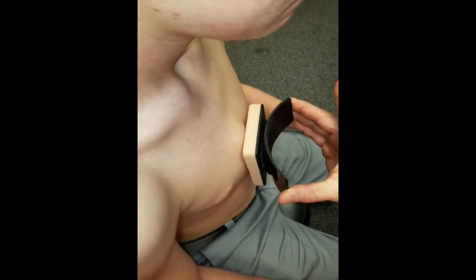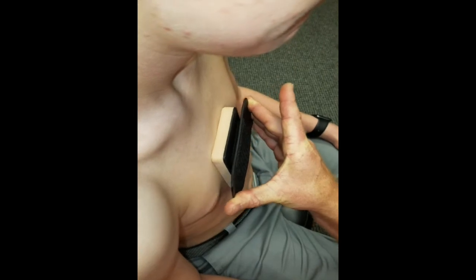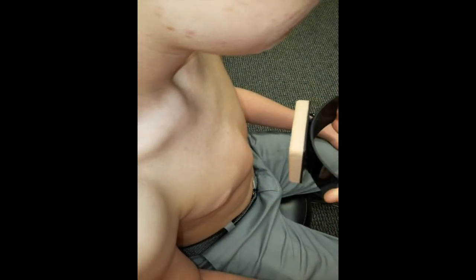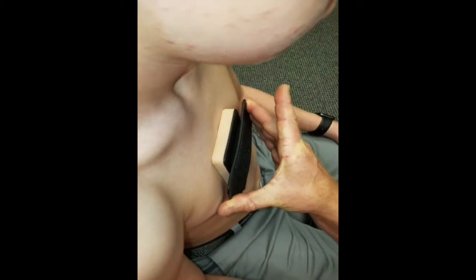The pectus embrace works through implementing pressure gradients with dynamic force plate technology to provide corrective compression over the affected pectus site. As shown here, the pectus is corrected when the dynamic force plate is flattened.